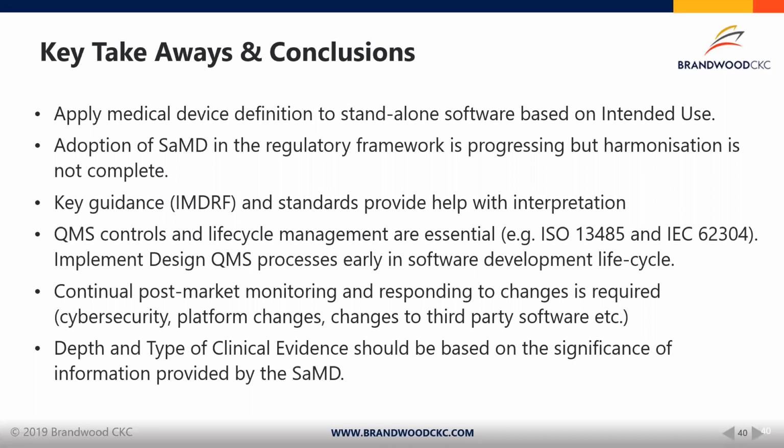So I suppose one word of caution: as I mentioned, in some of the regulatory frameworks, software as medical devices do tend to be low classified. This is not a reason to have a low level of clinical evidence. To facilitate the transition, you really need to clearly evaluate the kind of disease that your software may be involved with, the type of users, and the reliance on the data, and obviously investigate and evaluate the type and depth of clinical evidence that you have to put together in your technical file.